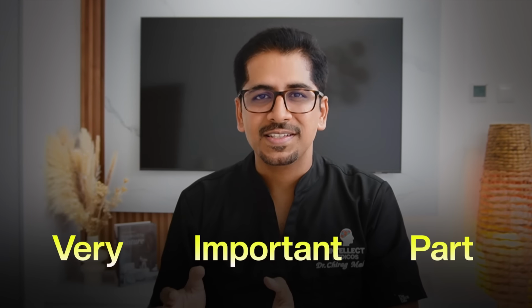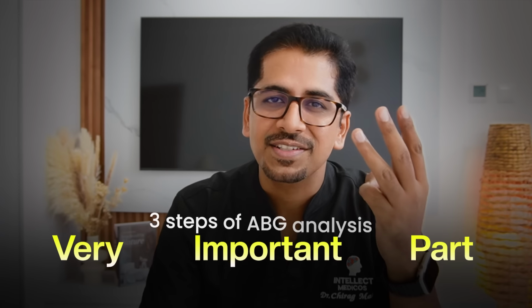Now, when you get an ABG in front of you, before interpreting, before reading the ABG, always try to have a brief clinical history of the patient, which might give you a clue that this might be the primary pathology or the disorder. Now, coming on to the very important part of this session are those 3 essential steps of interpreting the ABG.